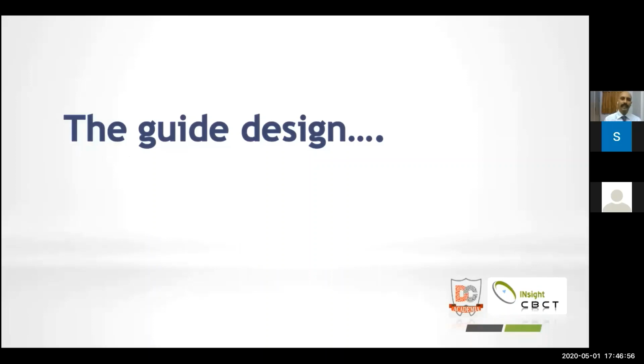Once this guide is designed and then approved by the implantologist, the next step is to generate an STL file. Now, what exactly is this STL file? STL stands for stereolithographic file. That is the format which the 3D printers understand. That's the language that the 3D printers understand. Like normal printers which take printouts on paper, either in black and white or in color, they understand the language which we can use, either as a Microsoft Word or an Excel sheet or stuff like that. So the format that is required here for the 3D printer is an STL format or a stereolithographic file.